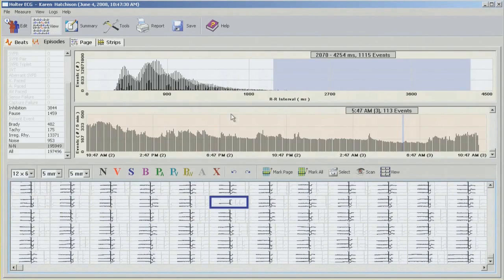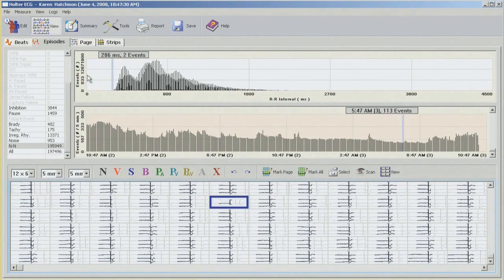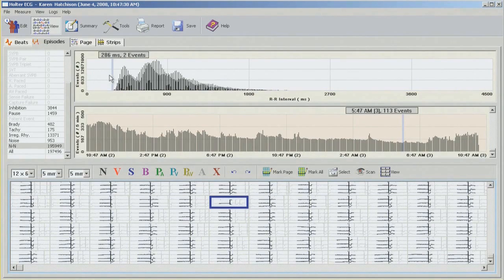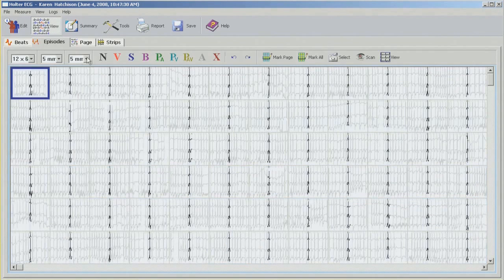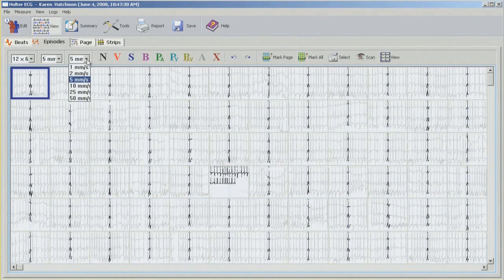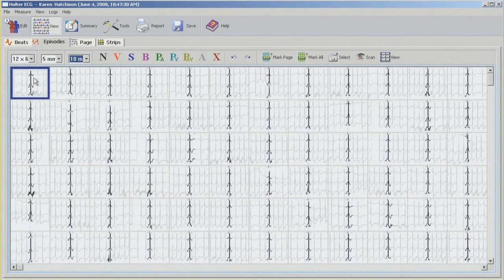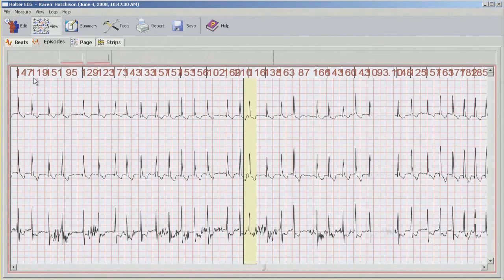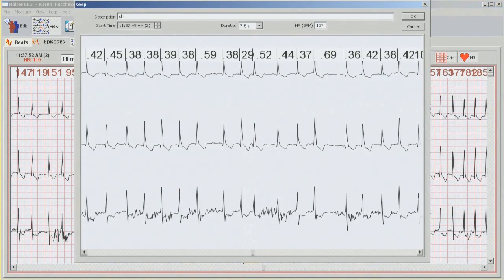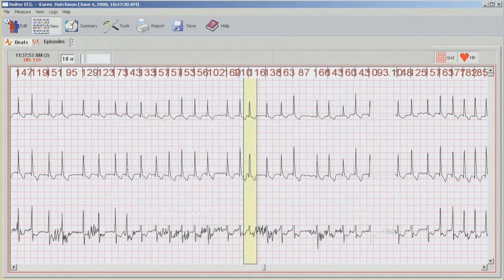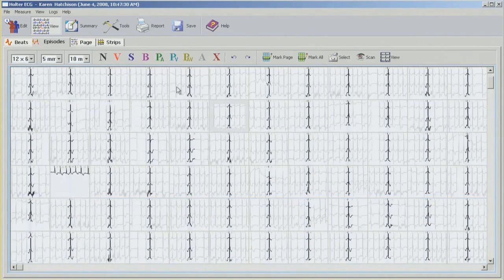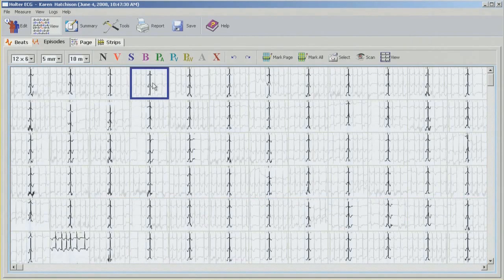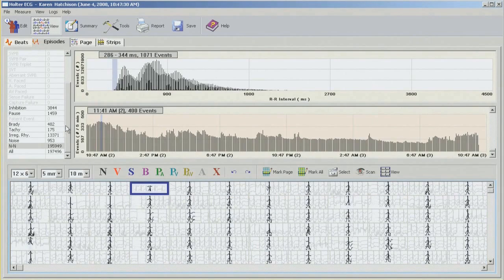And move on to the shortest one. So same thing, just going from the opposite side. Left mouse button down, hold it and drag over. Here I will change the speed again to 10. And this is our shortest NN, so just double click and select the label. Now I'm going to untag any of the boxes and use the Z button to go back to our previous screen.